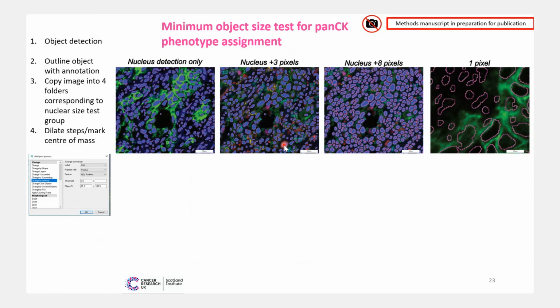And then what we did was we used the global phenotyping app or PixelMap with the deep learning. We went into the AI architecture, put the channel as an input channel or index 1 to cytokeratin. We then turned the app to a null classification. And then we went into the post-processing steps and said, change by intensity, label cell, or this blue label that we have here.